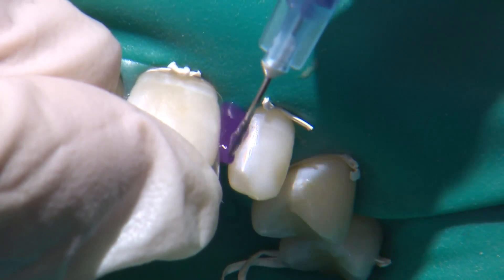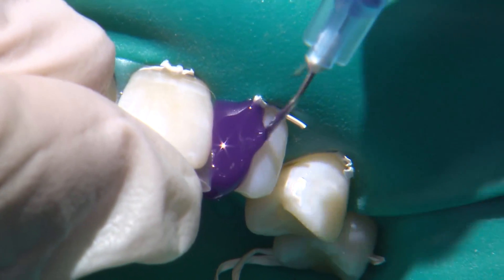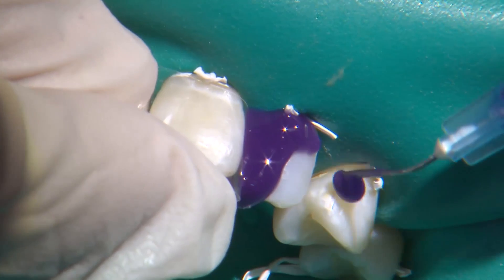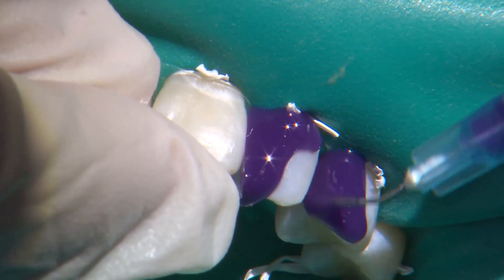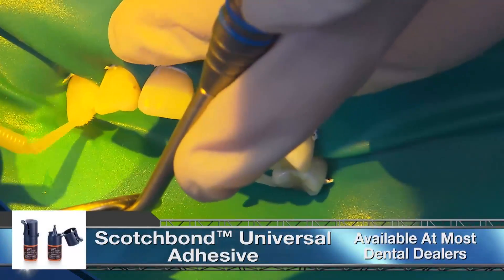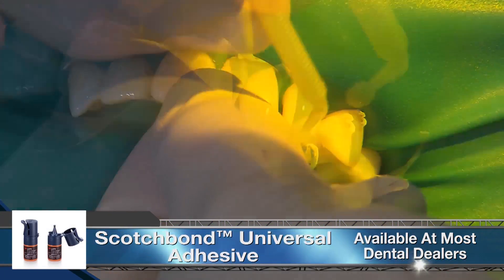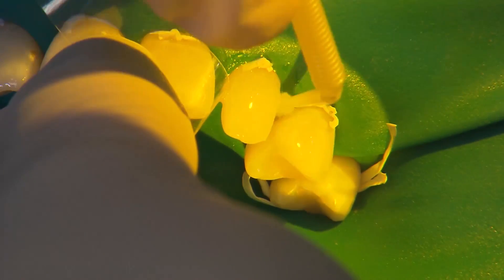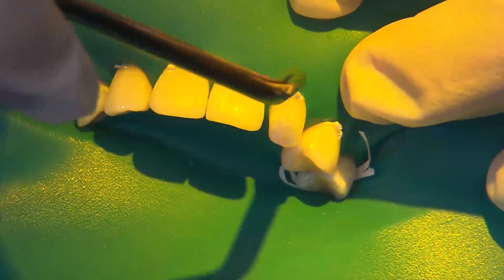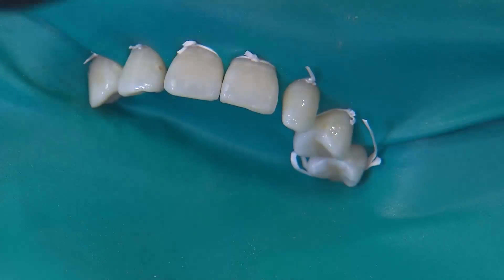When applying the etchant to the mesial surfaces of the laterals I protect the centrals with a clear matrix. You can also use Teflon tape to wrap the centrals, but I like to leave them exposed so I can visualize the distal contours as I'm applying the resin. Once I confirm the enamel surfaces have a frosted appearance, I apply Scotchbond Universal bonding agent to all of the bonding surfaces. Like the etchant, I extend the bond slightly beyond where I expect to apply the resin. Once applied, we air-thin the bond to ensure the solvents evaporate — the solvents are typically very volatile liquids like ethanol, methanol, and water, so they do evaporate very quickly.